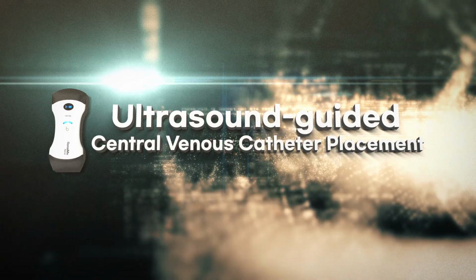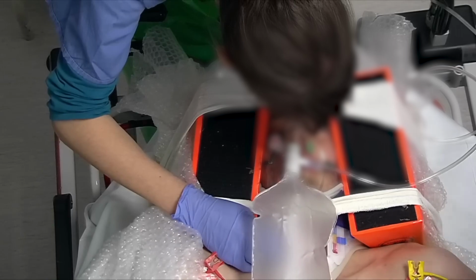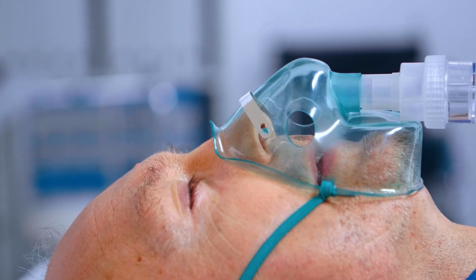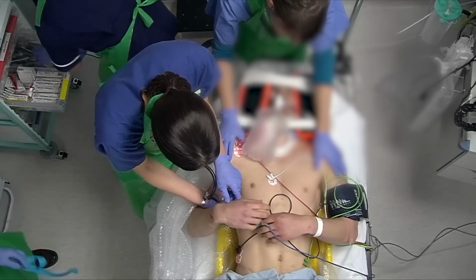Ultrasound-guided central venous catheter placement. The patient bleeds, prompting a quick eFAST ultrasound scan. The doctor identifies severe bleeding and the need for immediate intervention. Recognizing fluid loss, they decide to secure central venous access for rapid fluid delivery.